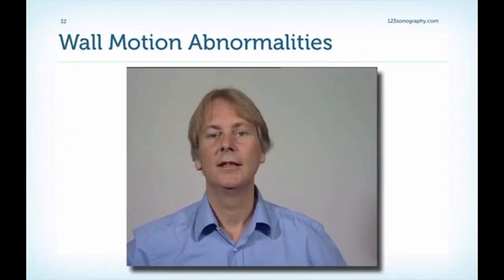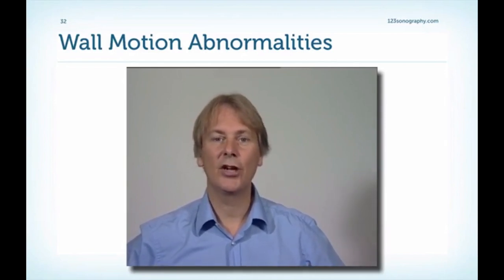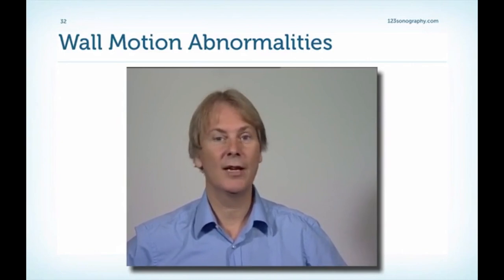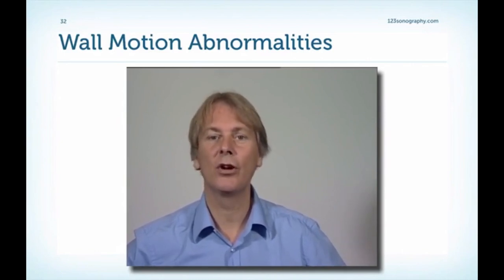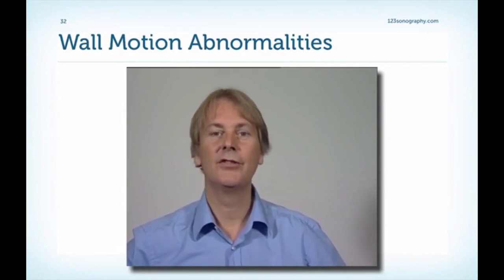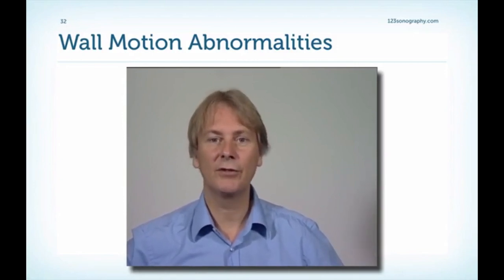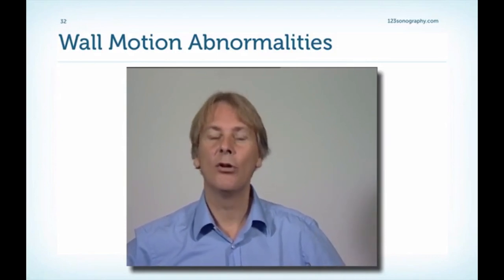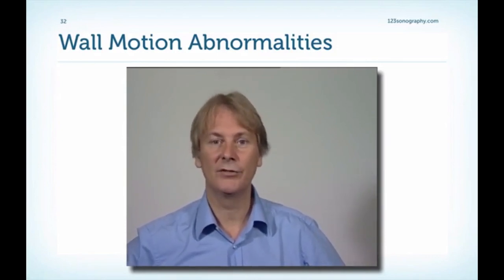So you see, wall motion abnormalities is a very complex issue. And keep in mind, it's not only hypokinesia or whatever dyskinesia, but there's much, much more. Think of all the factors and about the physiology behind it. And very important, always put yourself in the driving seat of the referring physician and the patient, of course, to get the most out of the exam and to answer the questions which are relevant.